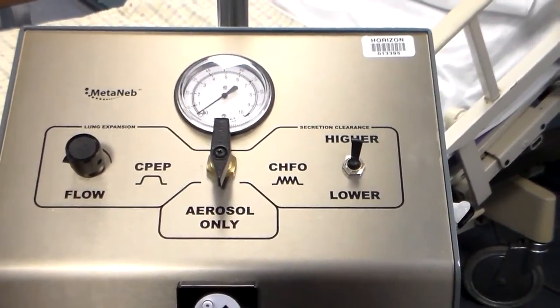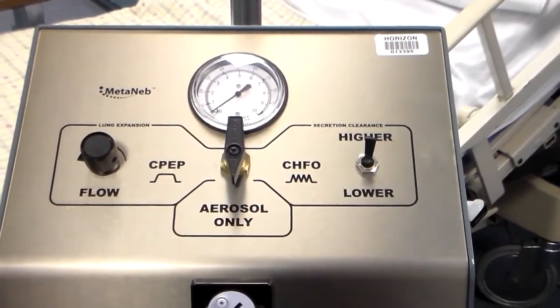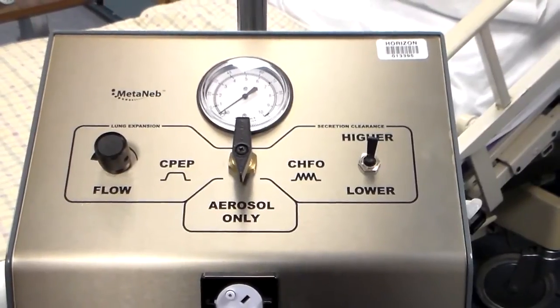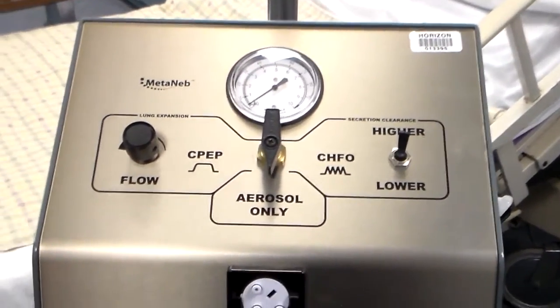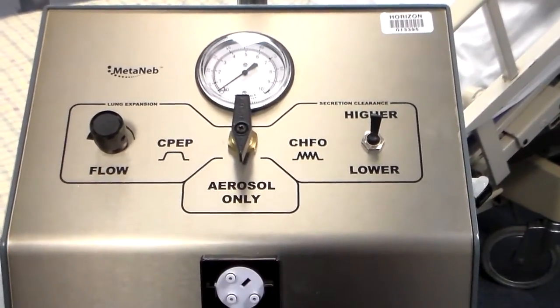CPEP, or continuous positive expiratory pressure mode, uses continuous positive pressure to help hold open and expand the airways. CPEP is designed to prevent or reverse atelectasis, aid in mobilization of retained secretions, and reduce incidences of air trapping.